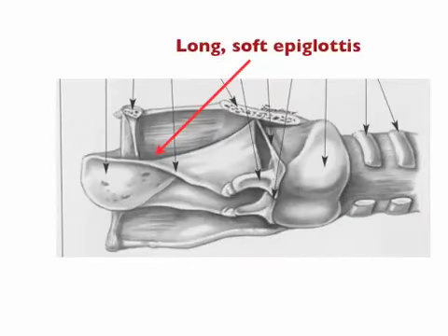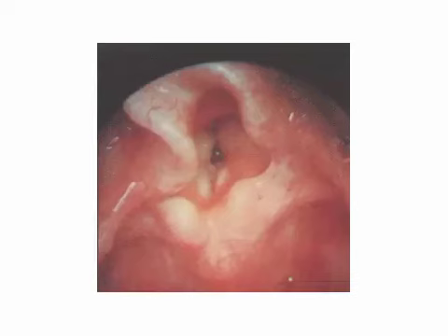This is a sideways cutaway view of the epiglottis and then the opening of the larynx, and you can see where the endotracheal tube would go in there. And children have this long, soft epiglottis which can tend to flop down and obscure your view of the vocal cords and where you're trying to get the tube to pass. And this is the front-on view you get when you're intubating a child, and you get the sense of the epiglottis at the top here being a bit floppy.